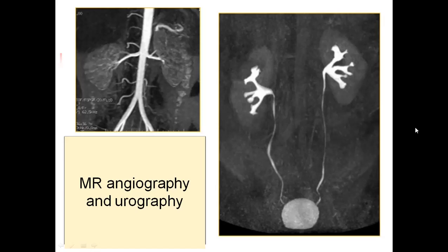If MRI images are images of hydrogen atoms, or in other words, molecules of water, we may ask the computer to choose this technique of study.